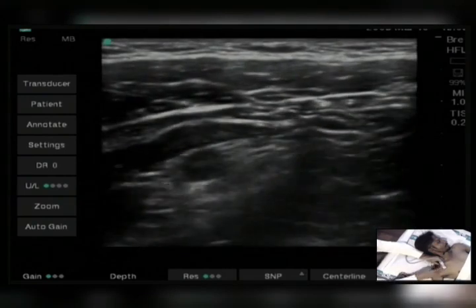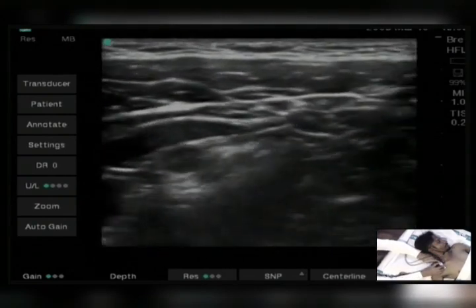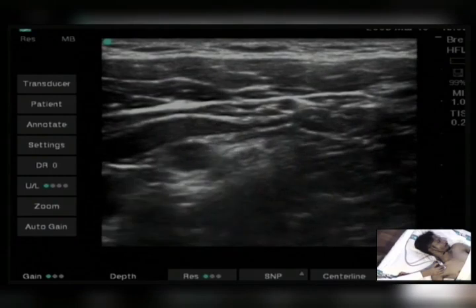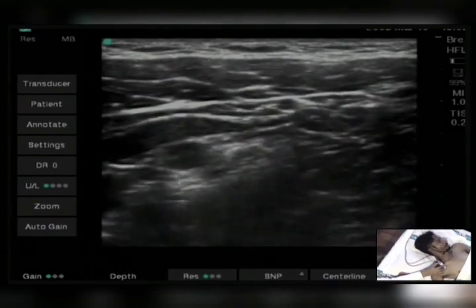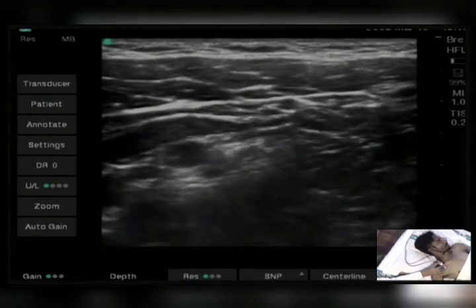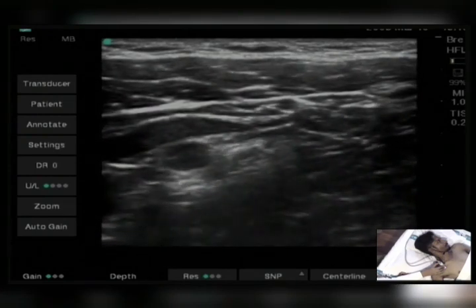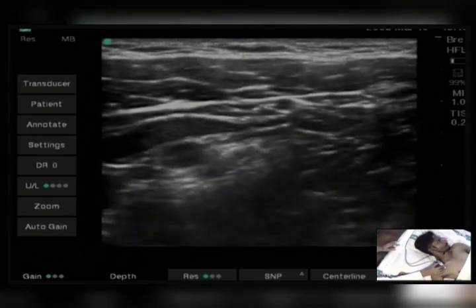Okay, the needle comes in between the clavicle and the probe from here, and I will reach the 6 o'clock position to the artery and inject the drug for the posterior cord, and I will look for U-shaped drug distribution. If distribution is not proper, then I will again redirect the needle to the 3 o'clock and 9 o'clock positions. So 15 ml in the posterior cord, 5 to 10 ml in the medial and lateral cords, so the total volume is 25 to 35.